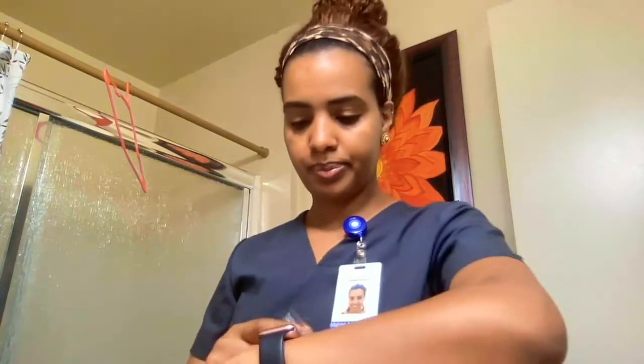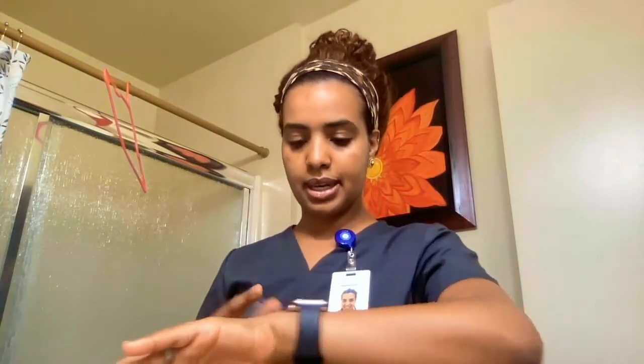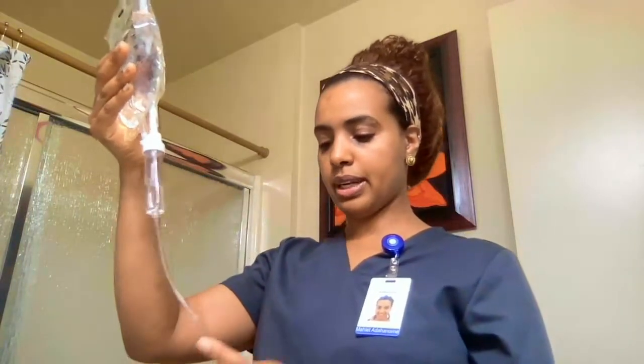My math gave me 38 GTT per minute. When I count, I make sure I count for a full minute. I'll check the time on my phone and count 38 drops per minute.